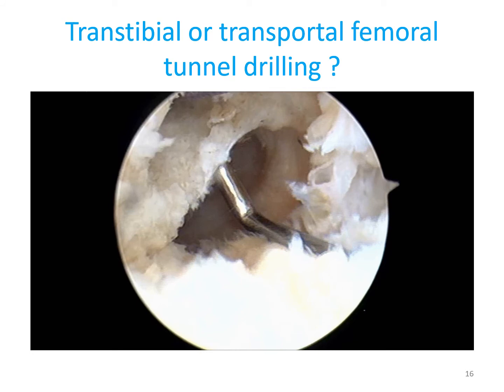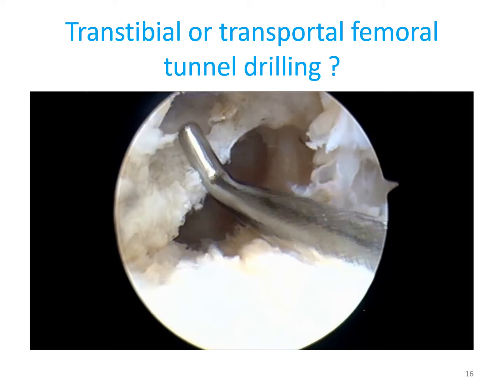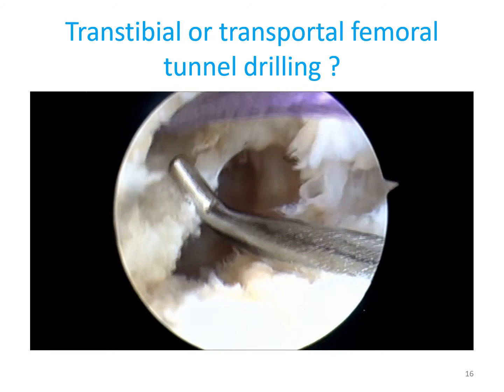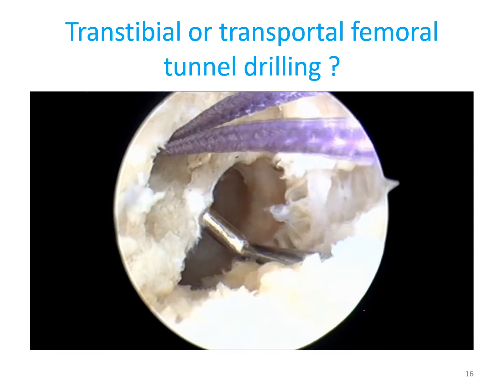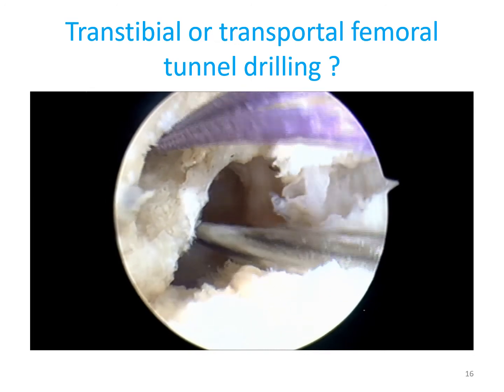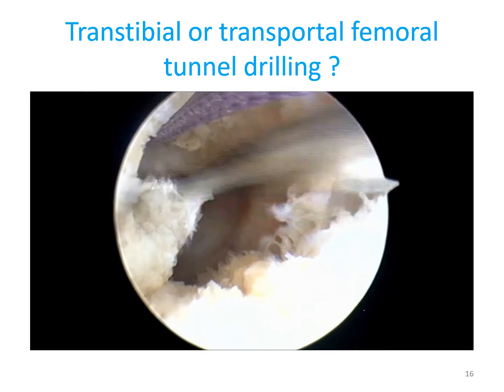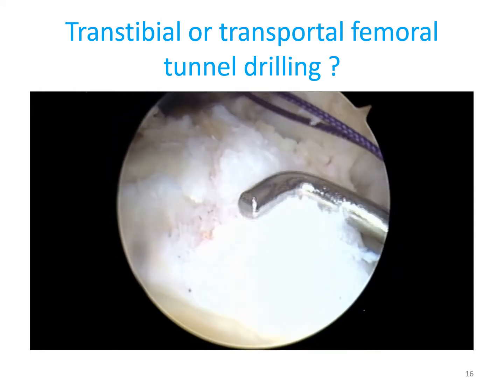So, drilling the femoral point, we were talking about the transportal drilling through the accessory medial portal. What about drilling through a tibial tunnel, which is anatomically done? So, a trans-tibial drilling. This is a transportal drilling. You can see it's horizontally oriented. This is the proper posterior wall. No blowout, and regarding the PCL, we will be almost 90 degrees with the PCL.